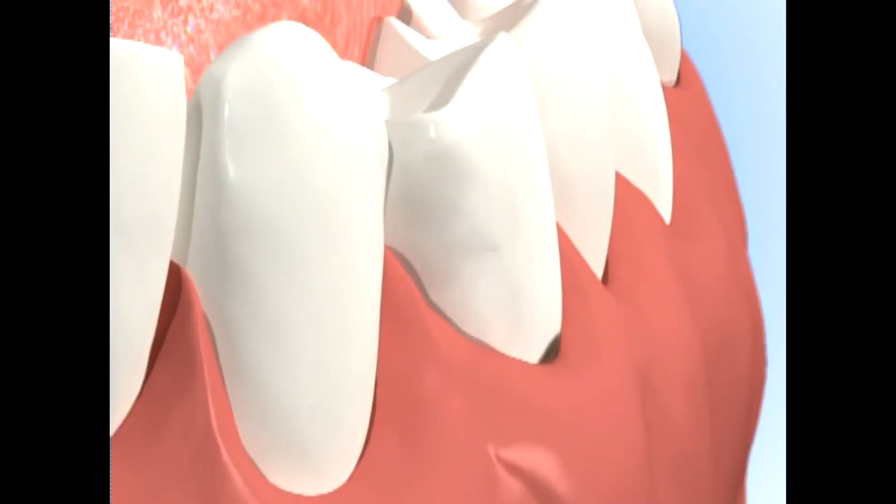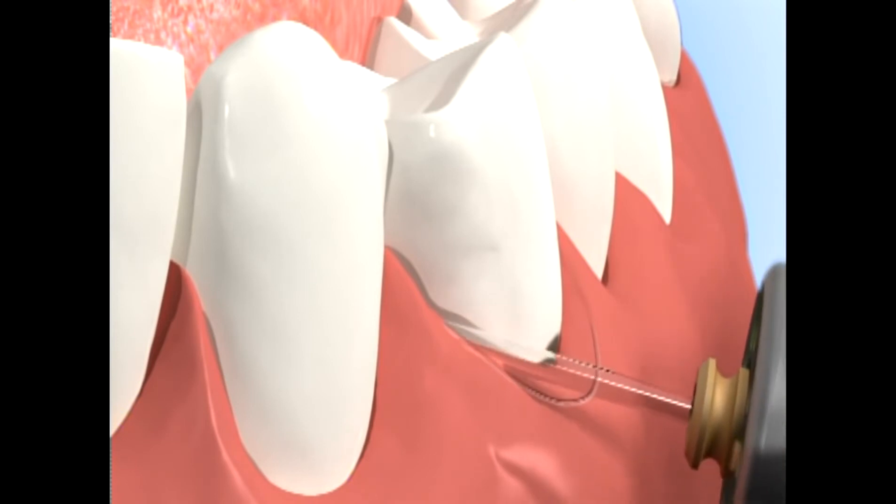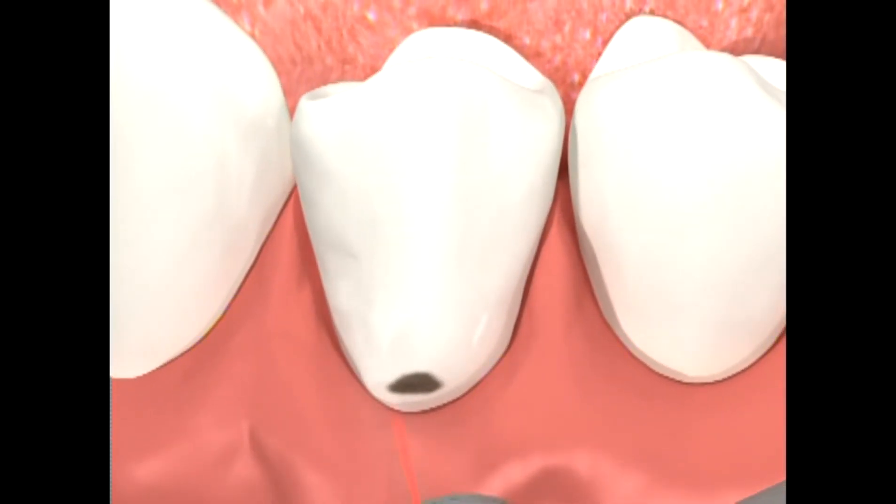To start the cavity prep, first check to see if access to the decay requires the removal of gingival tissue; remove any gingival tissue necessary to reveal the decay. Start about one centimeter away from the tooth surface and slowly advance toward the decay until ablation can be visualized. Slowly move the laser around to remove the decay completely. Frequently stop to check the cutting depth and focus-defocus accordingly. When the preparation is completed, proceed with checking for softness in the structure using an explorer, excavator, or a slow-speed round burr based on your preference.